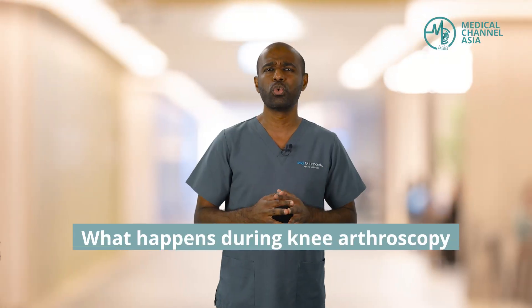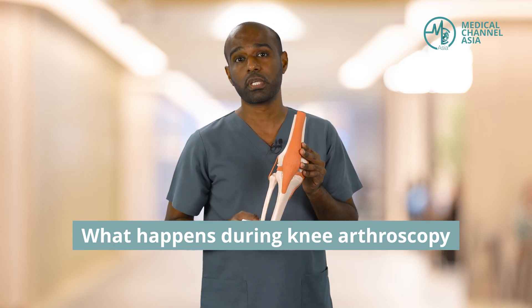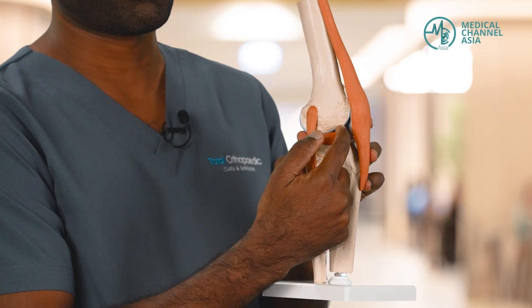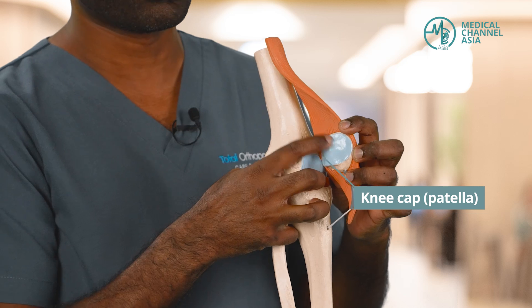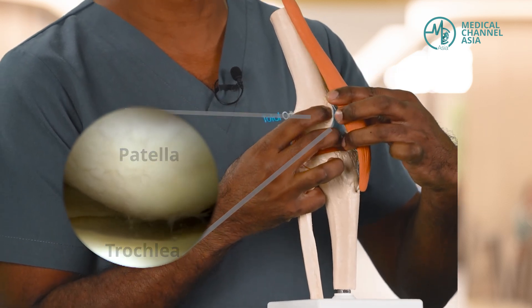Now, let me take you through what actually goes on during an arthroscopy. This is a model of the knee joint, and when we do arthroscopy, we insert a tiny camera in this aspect of the knee. When we go in, the first part we see is your kneecap, or the patella. We assess the cartilage on the patella, and on the articulating surface — what we call the trochlea — where the patella sits on.